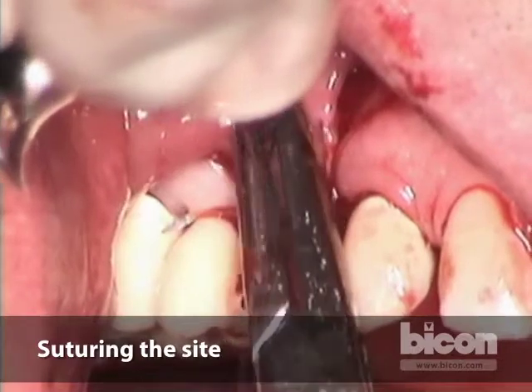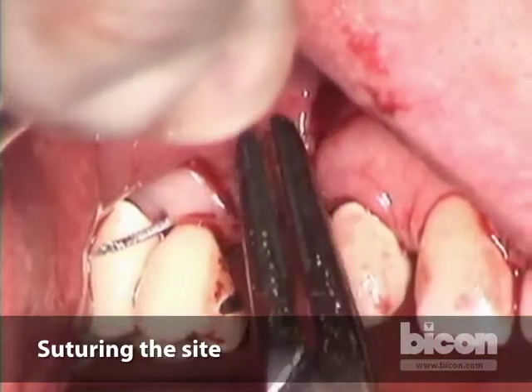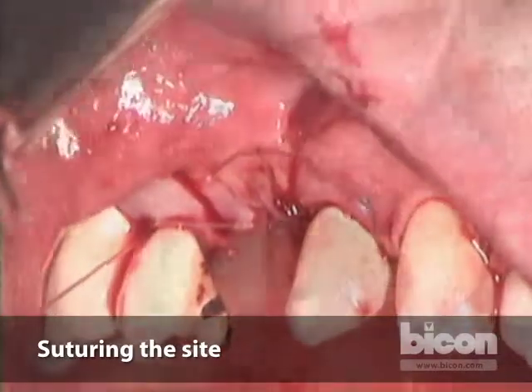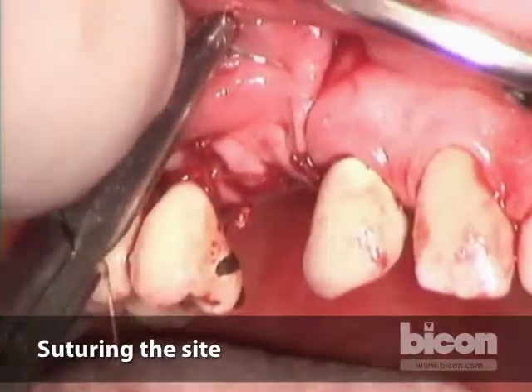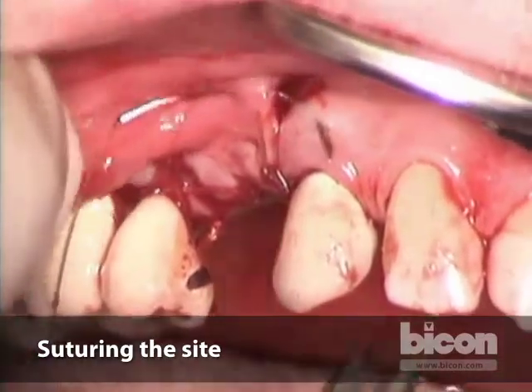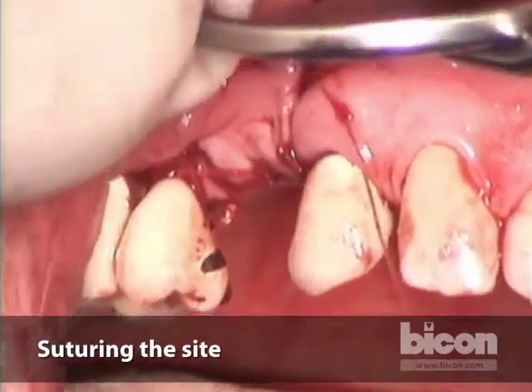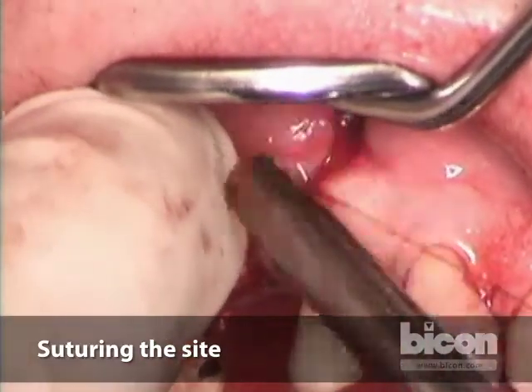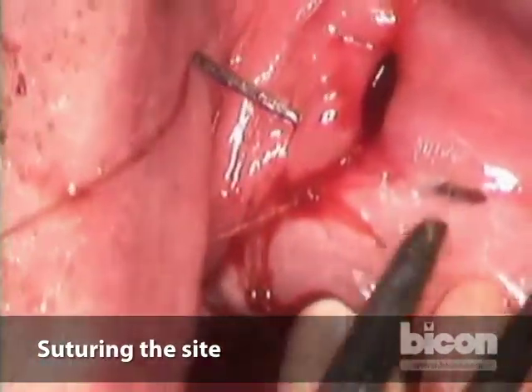Okay. Remember, this is a pontic space, so we're not violating the free gingival attachment of a tooth. That will soon be replaced. There we go. In these circumstances, sometimes a P3 needle may work better. However, we do have the FS2 now, and it's working okay. If we need another suture, we will use a P3 needle. Hold on.